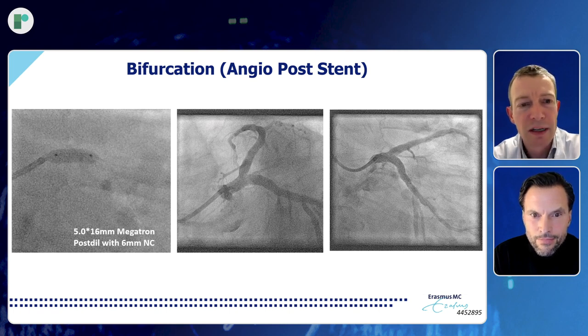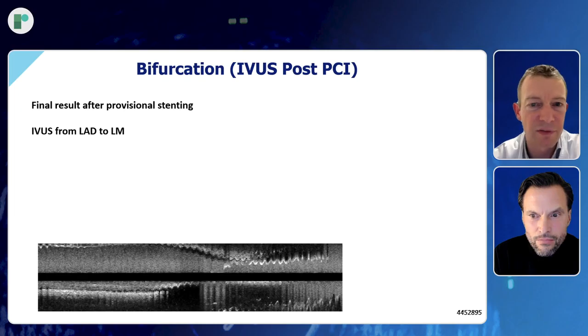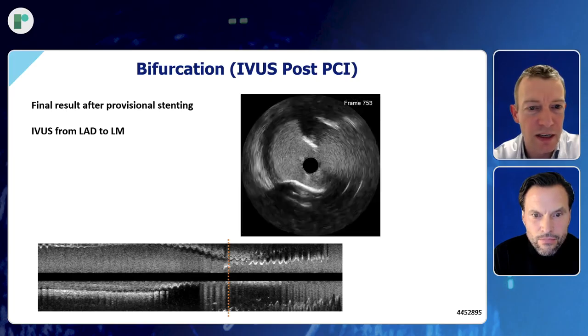patient. But no, that's obviously typically not what we do, because you have already the imaging catheter in place, so it's very easy to use it again to assess your post-PCI result. So I'll tell you the results in the circumflex was excellent, but what we also did is we rewired the LAD and actually looked at the ostium of the LAD after stenting this heavily calcified lesion in the circumflex. And this is the pullback from a LAD into the left main.